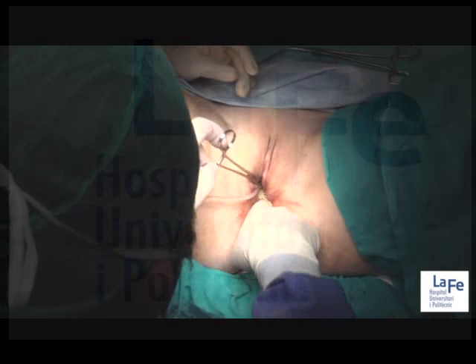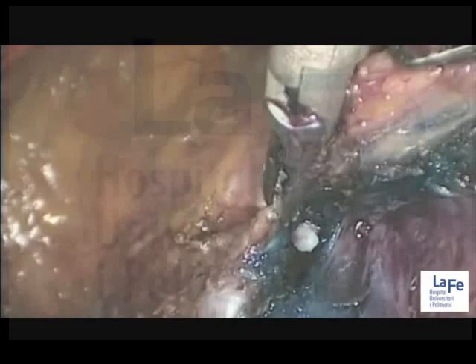The use of a uterine manipulator is avoided, and the colpotomy is only guided by a swab and a ramp. Once the vagina is opened, a glove with swabs inside is immediately placed inside the vagina to prevent gas leakage.